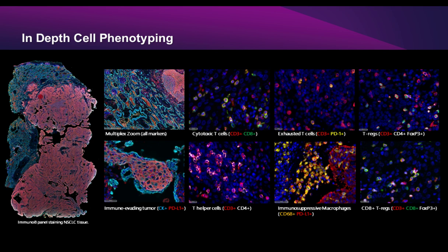Let's continue. Can the UltiMapper assay be used on fresh sections that have not been embedded in paraffin? We don't test that internally formally, but we have some customers that are evaluating that right now as we speak. It speaks to the same point that Scott had just made. They will require some fixation processing, and working that out and optimizing that is what would be required to see if our assay would work optimally there or not.